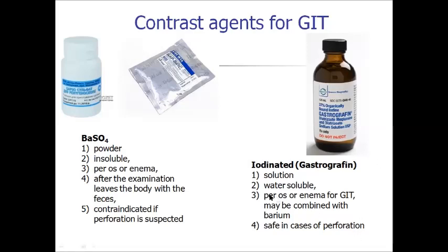They are water soluble, given per os or by enema for the gastrointestinal tract, and may be combined with barium sulfate, but it's not always necessary because gastrografin is a very good contrast agent by itself without barium. A very important advantage of iodinated contrast agents is their safety in cases of perforation.